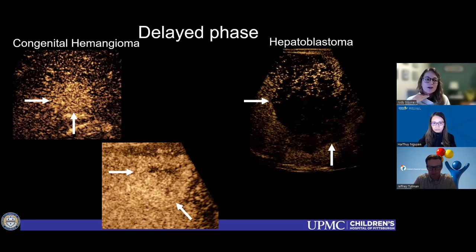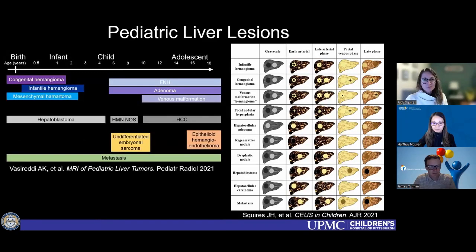So some people say, I can't tell the difference between all of these types of washout. And yes, you can. It's not that hard. You guys can do it, I promise. Okay, so that's my liver lesion evaluation talk, and these charts are all available online for you guys to find.